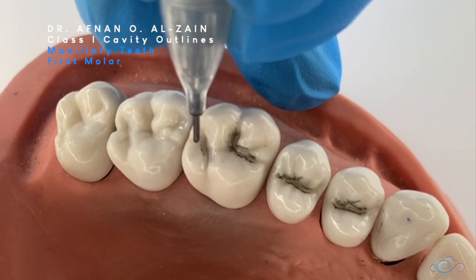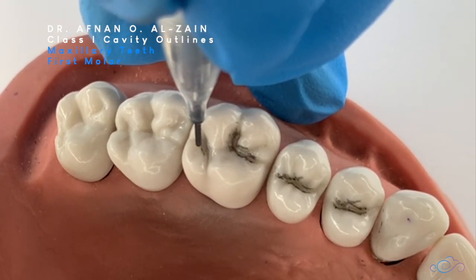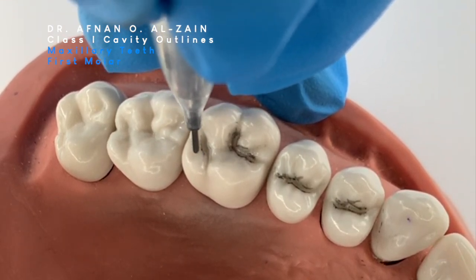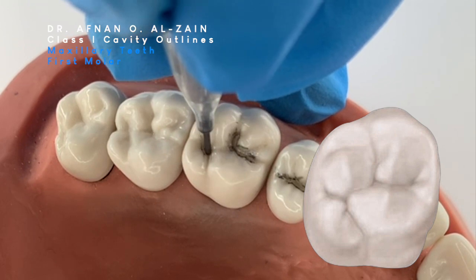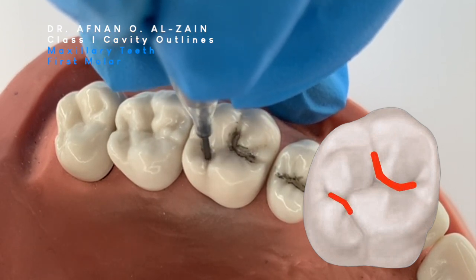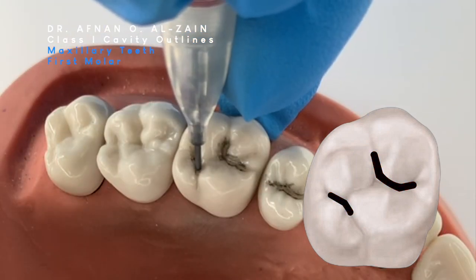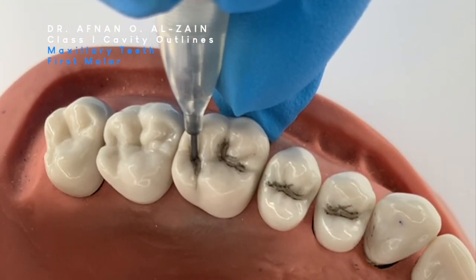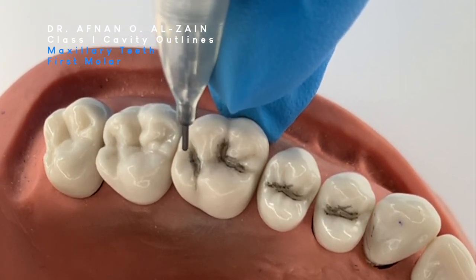Moving on to the distal — the distal is almost going to be like a straight line. We can see the groove here, so we're going to follow the groove, going a little bit lingually without weakening the lingual cusps, and then extending a little bit buccally. It looks like a little oval shape.